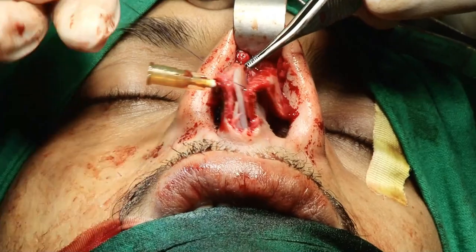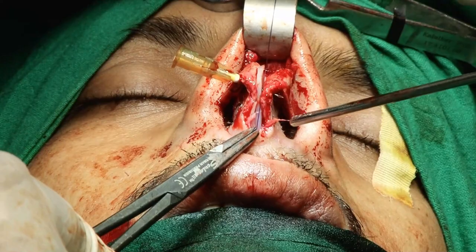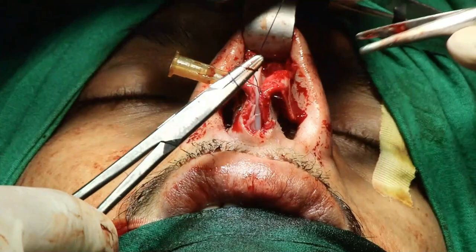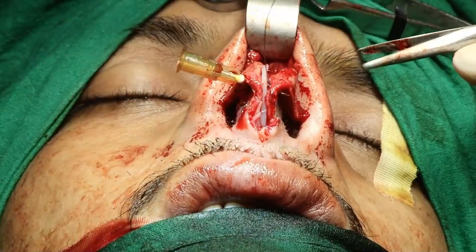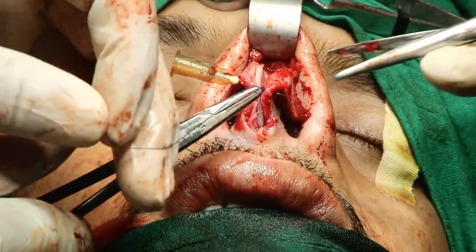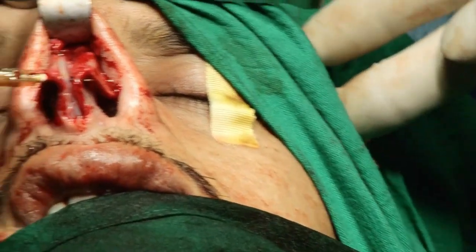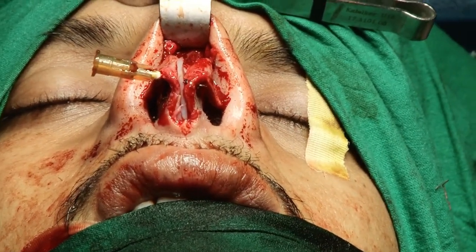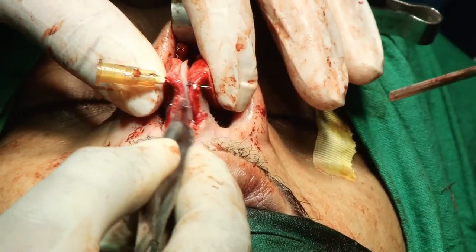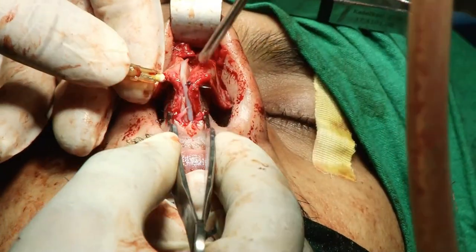So you never confuse the tongue-in-groove and the modified tongue-in-groove. There is another term sometimes, the tongue-in-groove setback. Tongue-in-groove and the modified tongue-in-groove we usually use for projection or to reduce excessive columellar show. But the tongue-in-groove setback is just for deprojection. In the tongue-in-groove setback we separate the medial crus from the attachment, then make an incision and overlap.